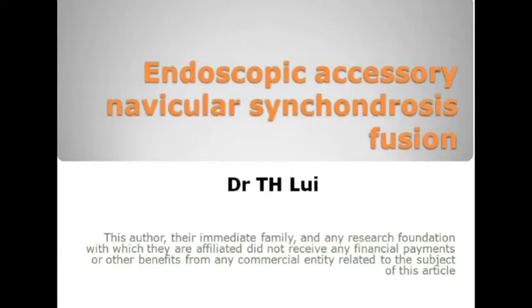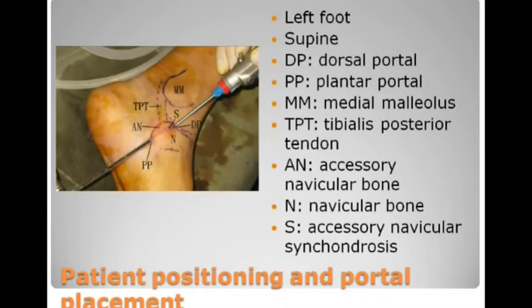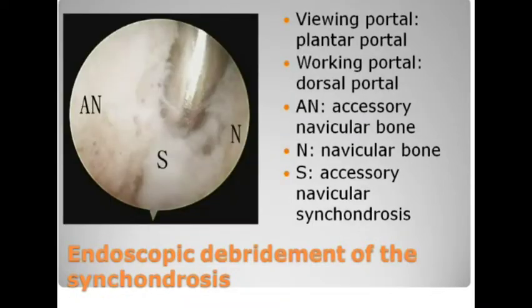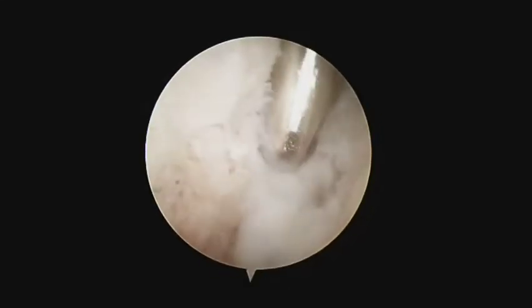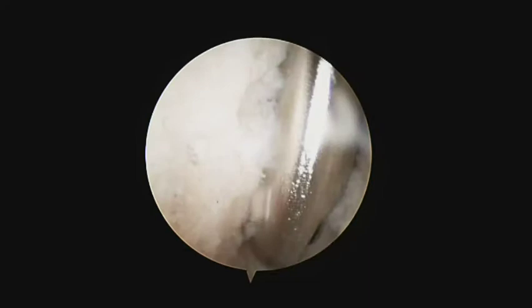Endoscopic accessory navicular synchondrosis fusion. Synchondrosis endoscopy is performed through the dorsal and plantar portals at the dorsal and plantar ends of the synchondrosis.